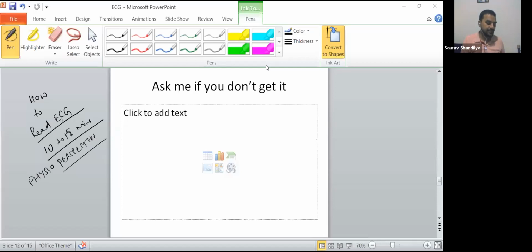So in 10 to 15 minutes, you can just see the T wave. I did not tell anything else. I think I told you it should be upright, especially in leads 1 and 2, and even V2 to V6, it's not down. T wave inversion is not possible here. Okay. How will you read?